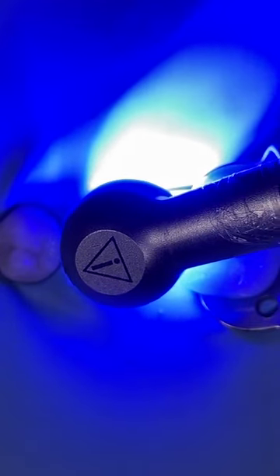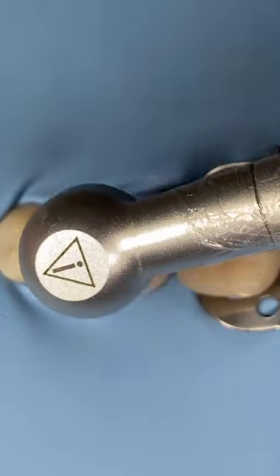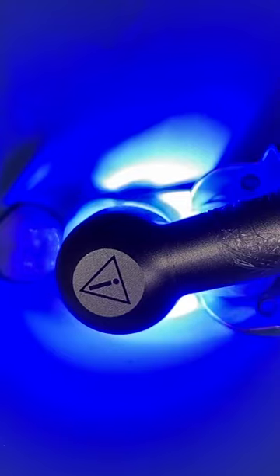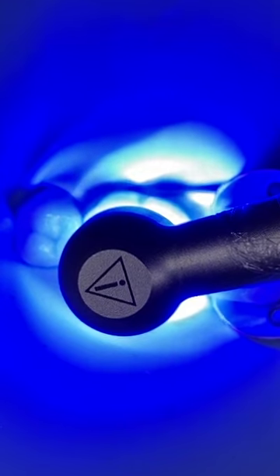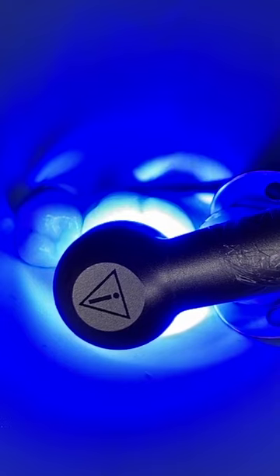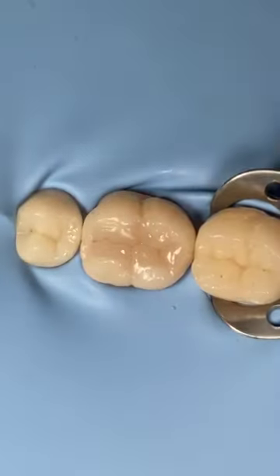You have glycerin. You can use glycerin. If you have glycerin, you can do a 5-second cure. You have to do an initial cure, and after that, put the glycerin, and then do the last cure, the longer cure. So you can use glycerin to improve the polishing ability of your surface, and for a better polymerization.